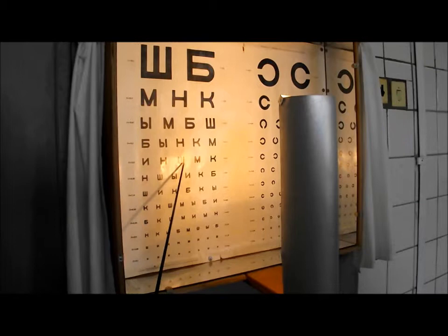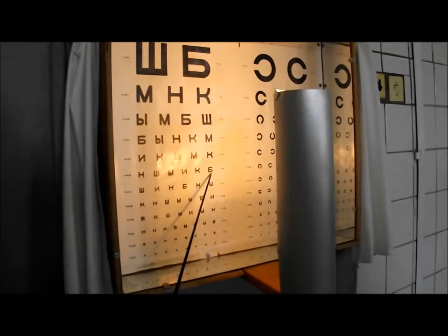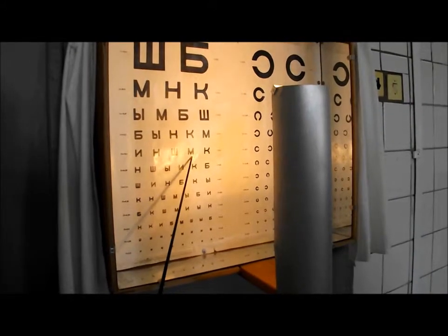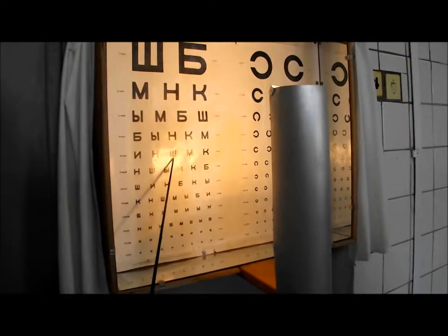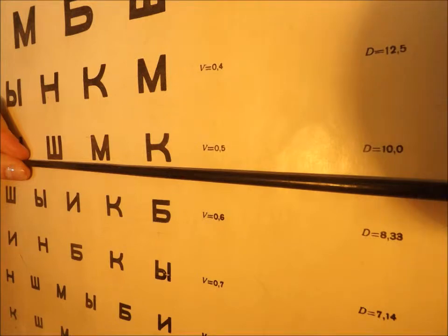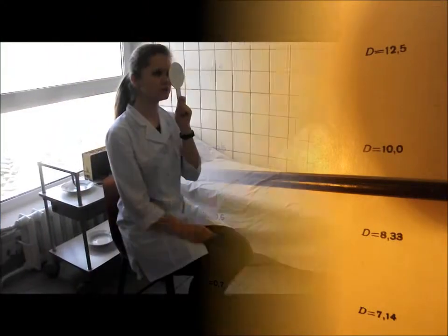The person under the test has 2-3 seconds for answering. Start the definition from the upper line of the letters, then move the pointer down the table until the first mistake of the person under the test. After that, raise the pointer to the previous line of the letters and check the correctness of calling all the letters. Visual acuity is 0.5. Then change the eye and repeat all the procedure.